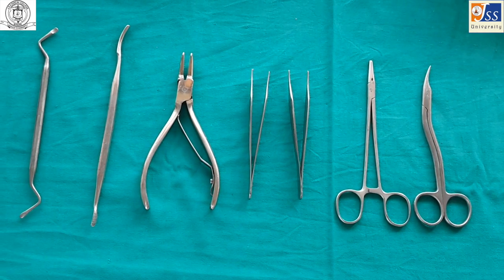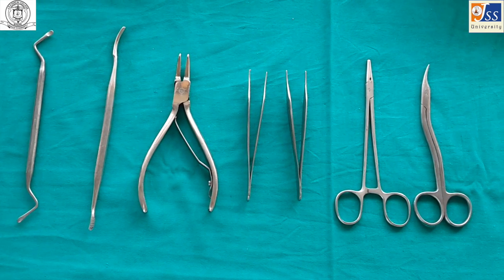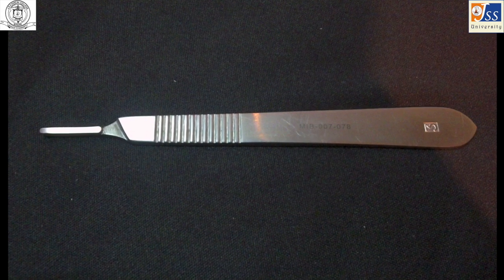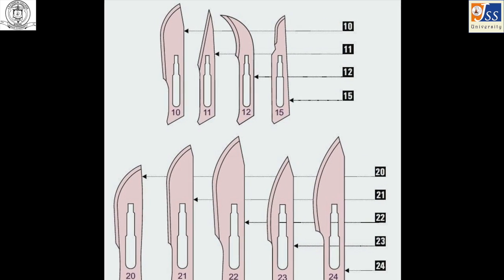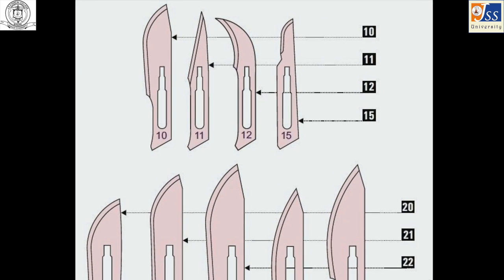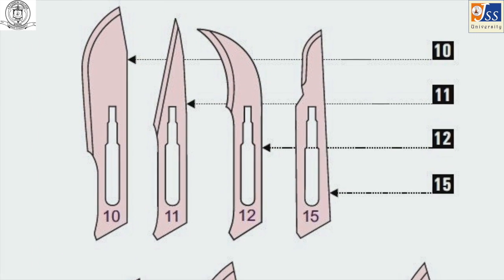After extraction of a tooth, some accessory procedures may be necessary to ensure proper post-operative healing. The Bard-Parker handle (BP handle) and Bard-Parker blade (BP blade) are used for placing incisions. In minor oral surgery, usually number 11, 12, or 15 blades are used.